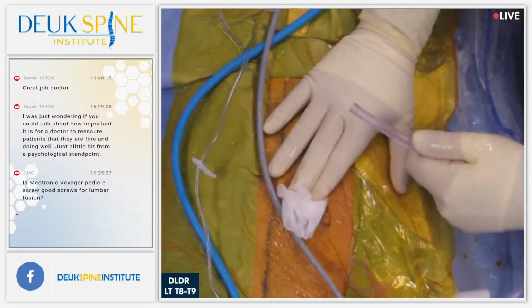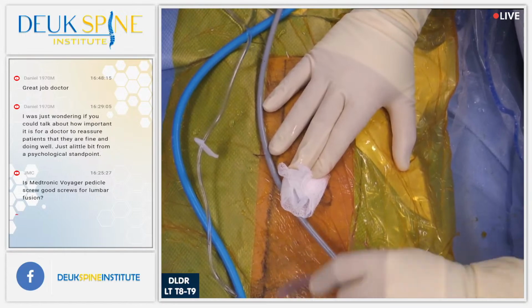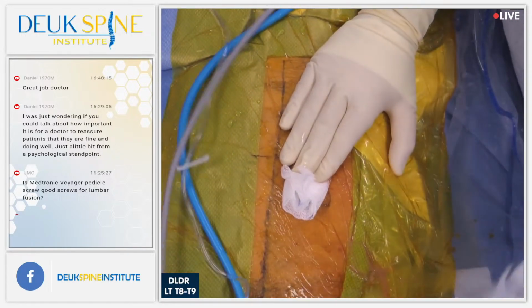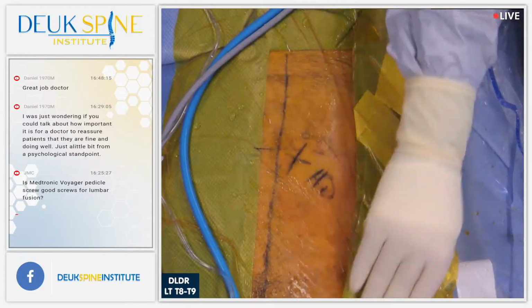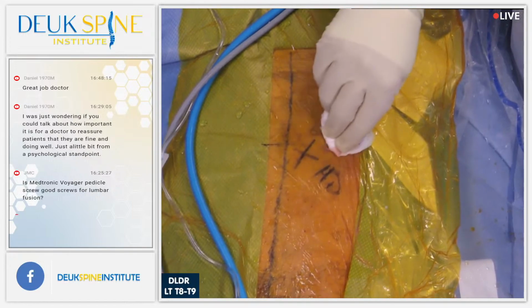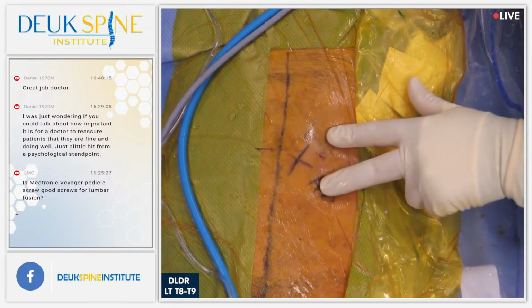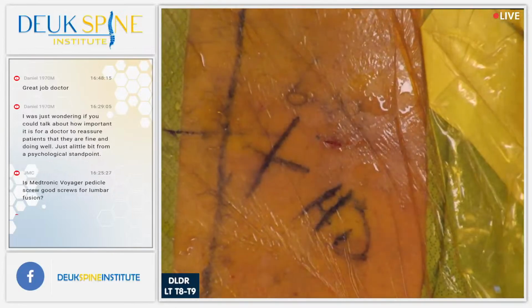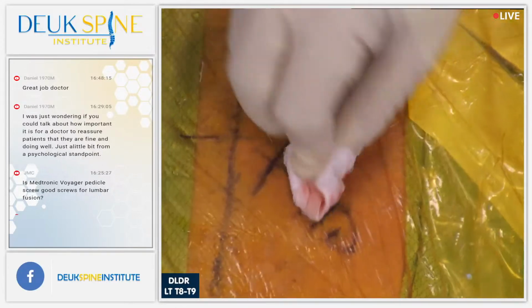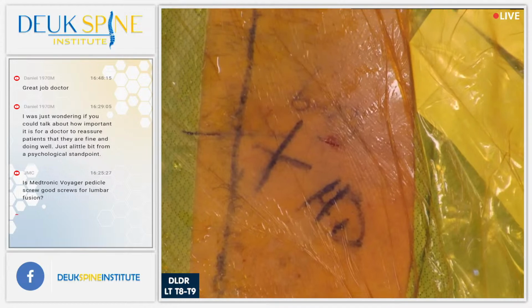Let's show you the incision. It's a more balanced technique to use. Is that better or worse? Way better, if there is narcotic. Yeah, but he didn't want any. So look at that. That's a 5 mm incision. We just repaired a thoracic disc herniation right where his pain was. I had him mark it out before surgery. We'll put a Band-Aid on there and he'll go home today with his daughter. They're visiting from Brazil to have his surgery at Deuk Spine Institute.